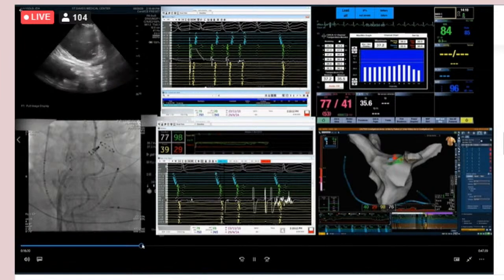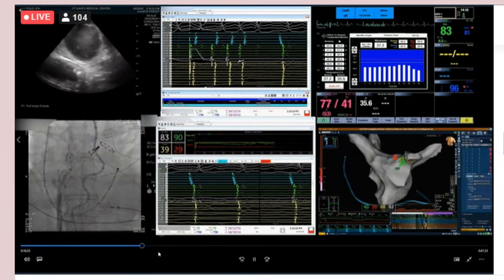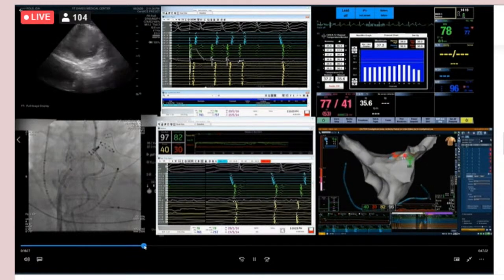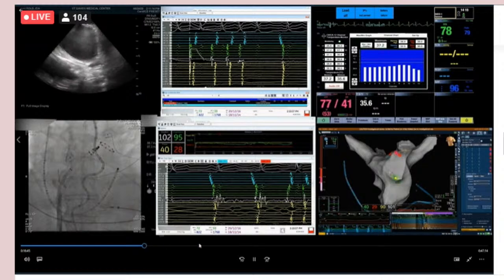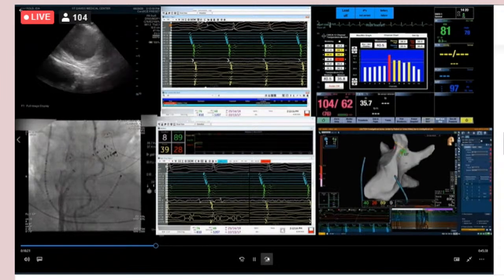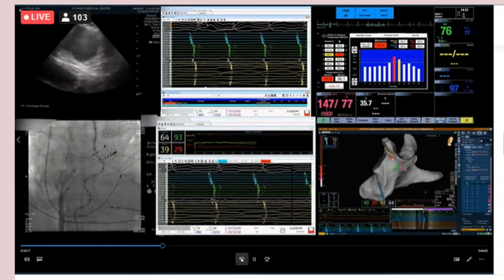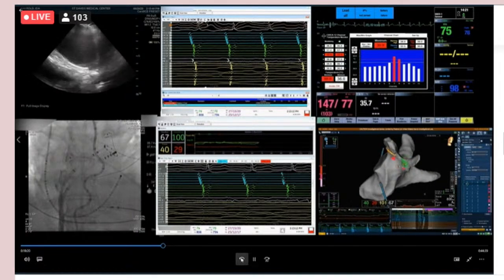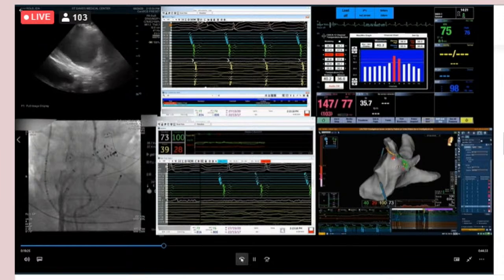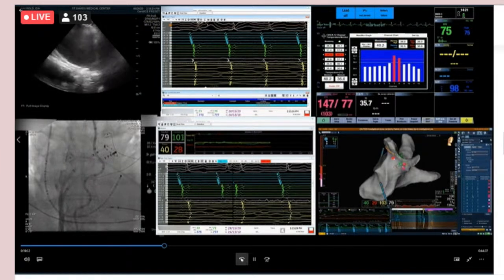You can see the pulmonary vein signal. There's a slight bit of delay there as the catheter is rolling around the anterior part of the vein. Maybe we can forward a little bit, not too much, just to see isolation. It looks like this is on both sides, and you can still see the delay there, and then it's isolated. Up, and then it's back, and then it's isolated. So I don't know exactly when this will be out, but I think the clinical study is actually done, so it should be soon, yeah.